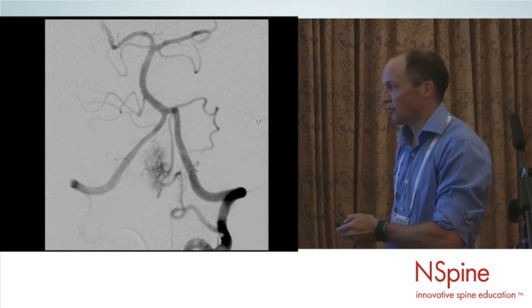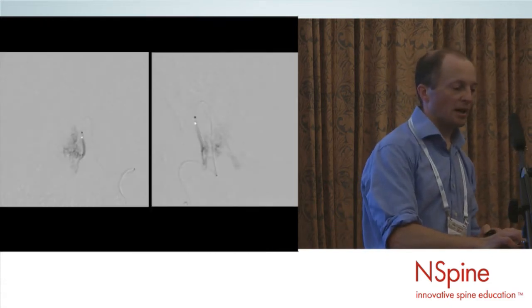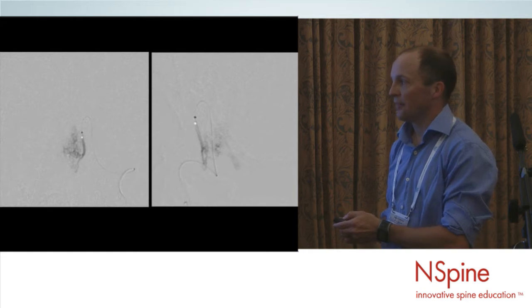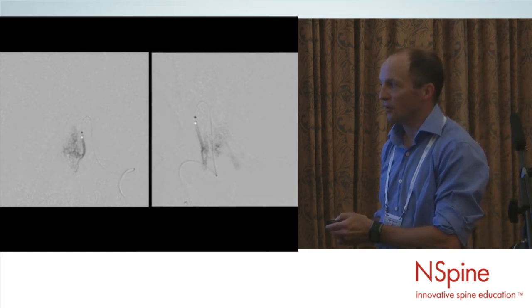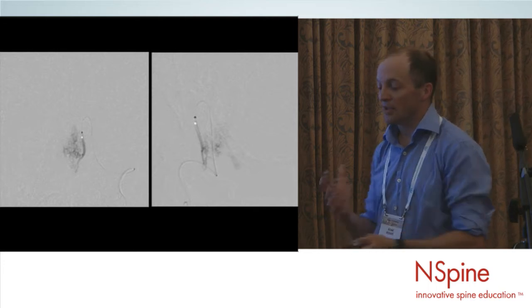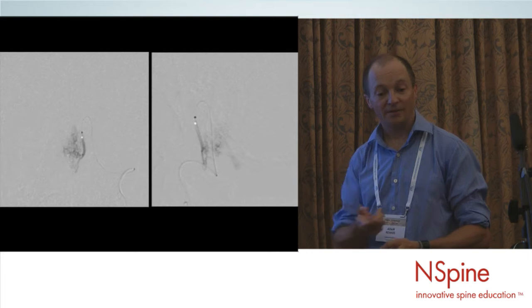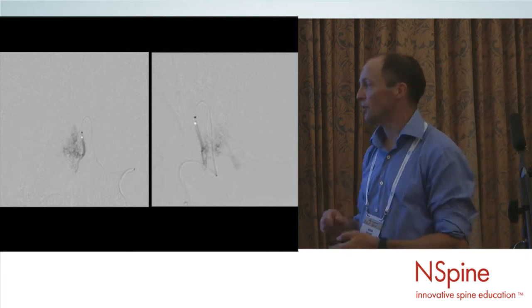this is actually a posterospinal artery, and you can see that in the lateral. As I've injected the anterospinal axis here, pop the catheter in, and in order to treat this, I'd want to get into the nidus, so come off the main axis and into the main nidus itself, and be injecting glue away from the anterospinal axis. So if glue did come back, I'd have an element of time before it blocked the main artery.